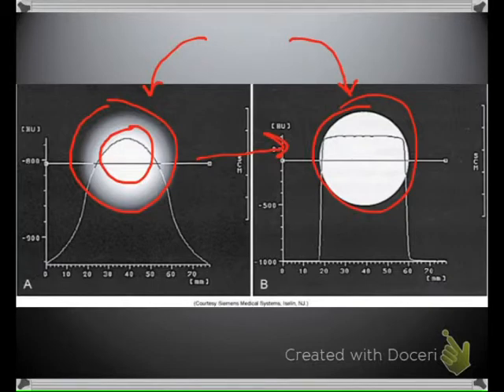And as we can see, the graph demonstrates that in itself. The graph has a curved shape, meaning here is the most dense, and as we can see here, it's equal density throughout. And so this filter does a remarkable job of improving image quality.